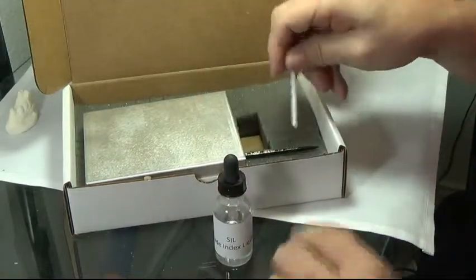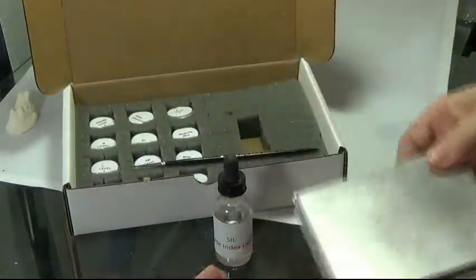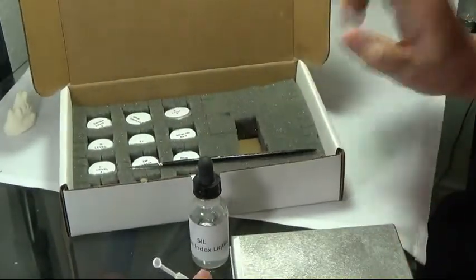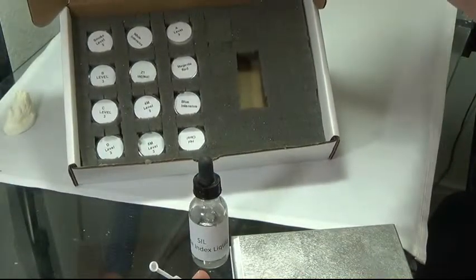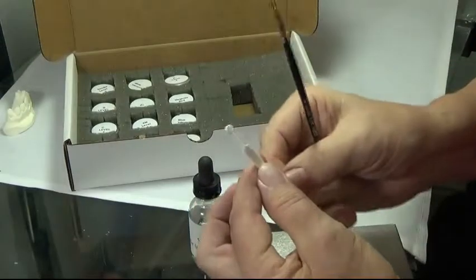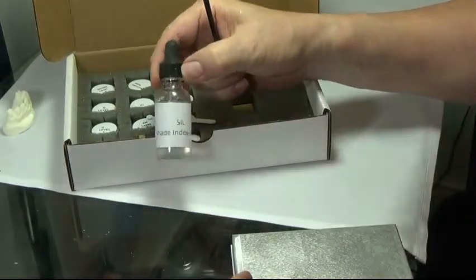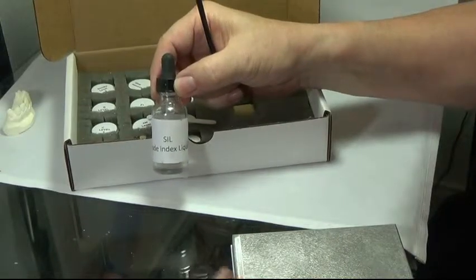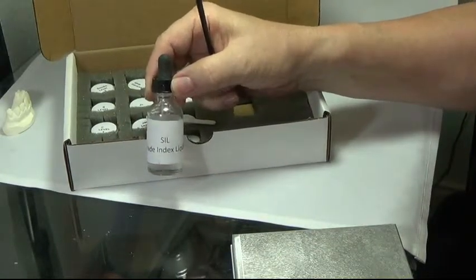We provide you a scoop for the refill powders in your kit. When you go to refill a used reservoir, you put 1 scoop of your powder and 3 drops of your shade index liquid, and that will give you a smooth flowing consistency product.